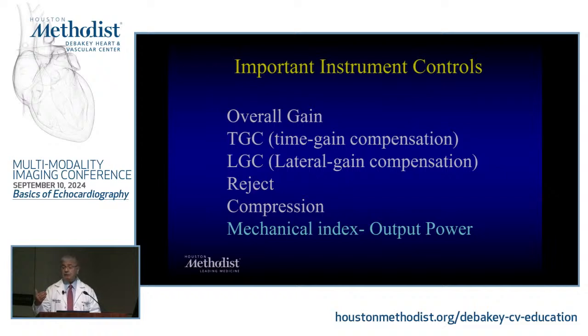The regulatory people always take a look at how much energy you're sending out to the body, right? Remember, with ultrasound, you can have lithotripsy. You can be very strong, so it depends on the energy. And here, the mechanical index is the energy that is framed within physiologic ranges that doesn't hurt the body nor the structures that you're talking about.